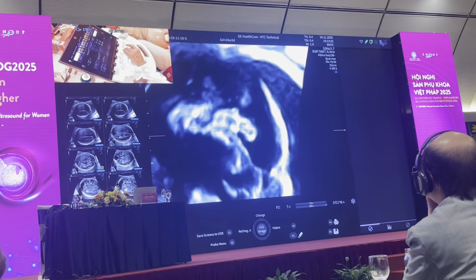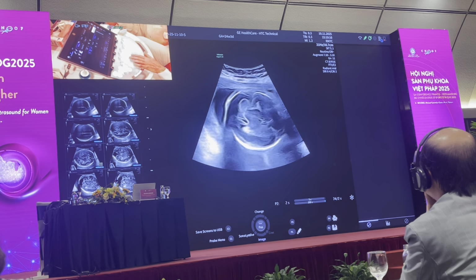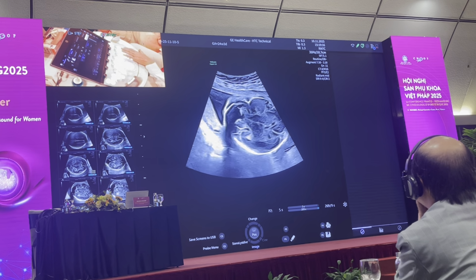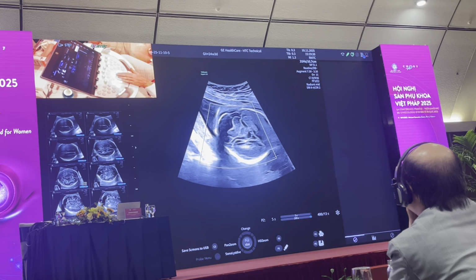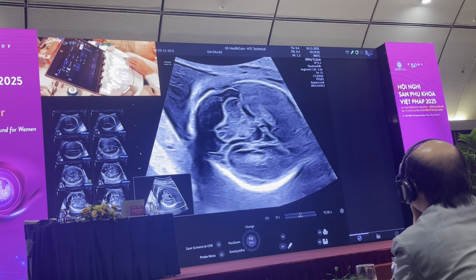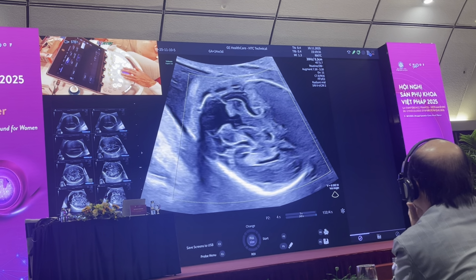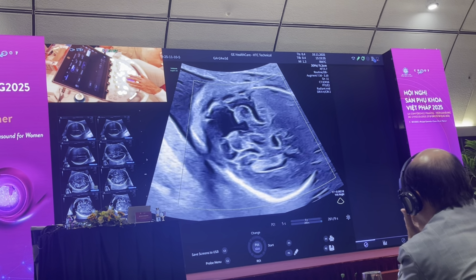This is my first volume of acquisition, and I would like to see whether I can improve on getting a better view of the posterior fossa. I'm still seeing a slight discordance in the cerebellar hemisphere because I think that the cerebellum is just very, very slightly rotated. So anytime I see any slight rotation of the vermis, I always ask myself the question, is there any evidence of an arachnoid cyst? Now you can see on 2D the communication between the third and fourth ventricle.